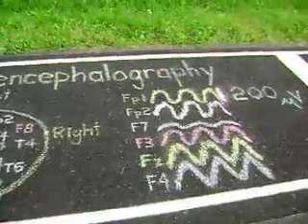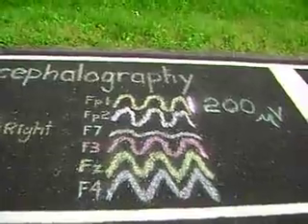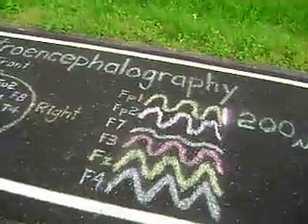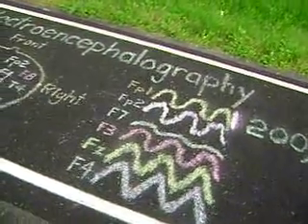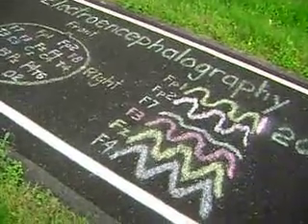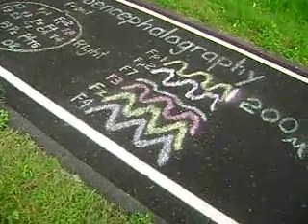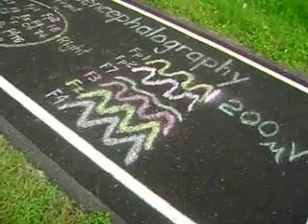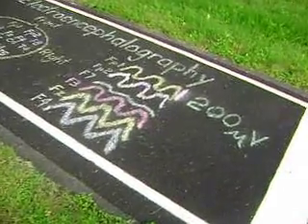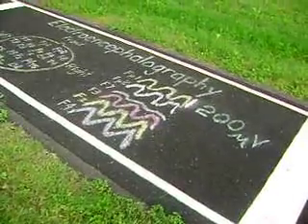Nevertheless, their presence in combination with clinical information frequently allows one to make a diagnosis in terms of recognized electroclinical syndromes. Ictal discharges or electrographic seizures provide irrefutable evidence of an epileptic seizure disorder. In generalized epilepsies, electrographic seizures may consist of a prolonged run of otherwise typical interictal discharges, but in partial epilepsies, this is rarely the case, and the ictal patterns have their own morphologic features.